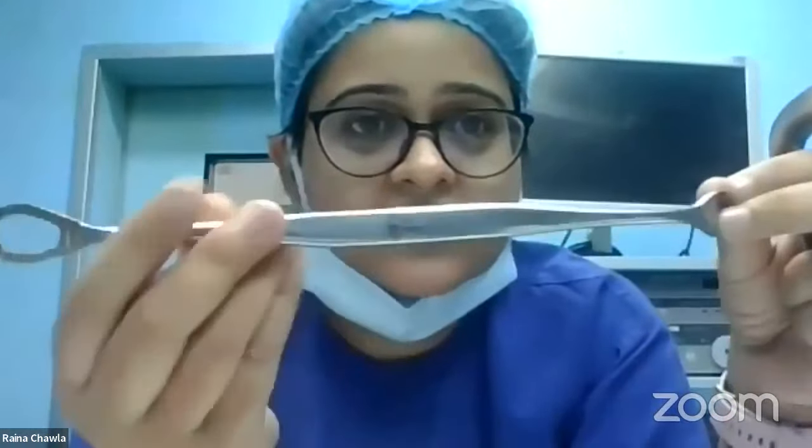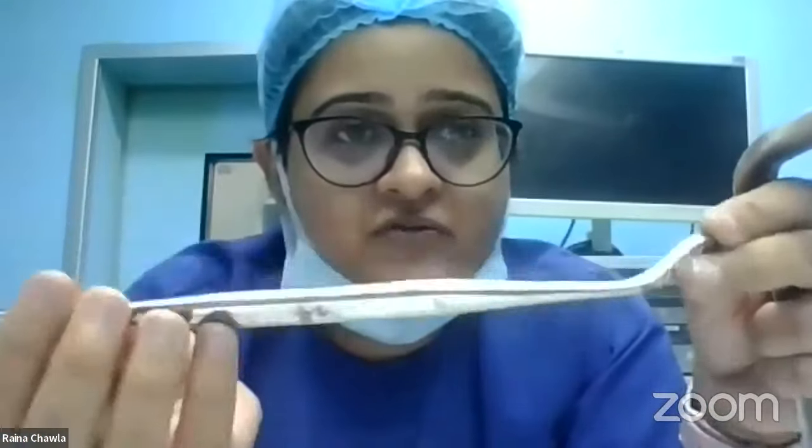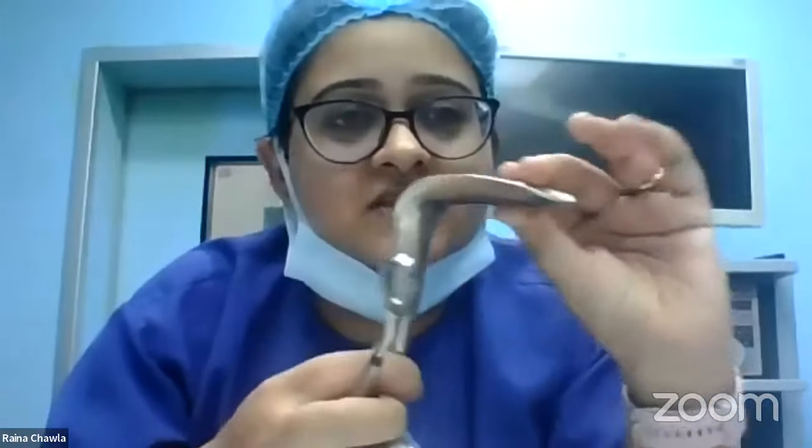And it is never used alone. Remember, it is always used along with this instrument. This is called an anterior vaginal wall retractor. For short, we call it an AVR. So what we do is we introduce the speculum.